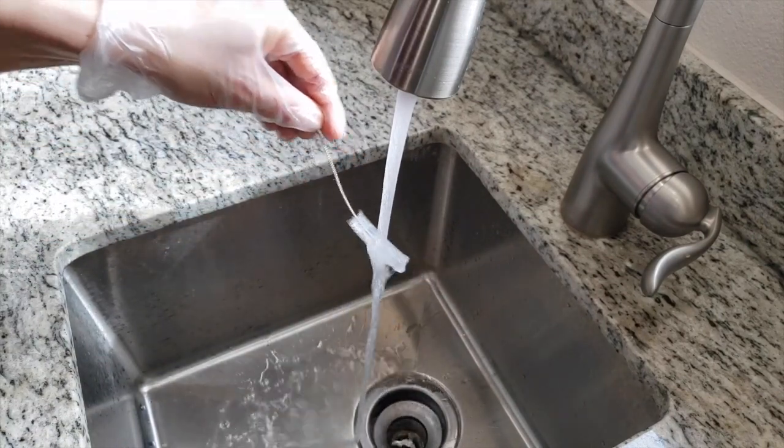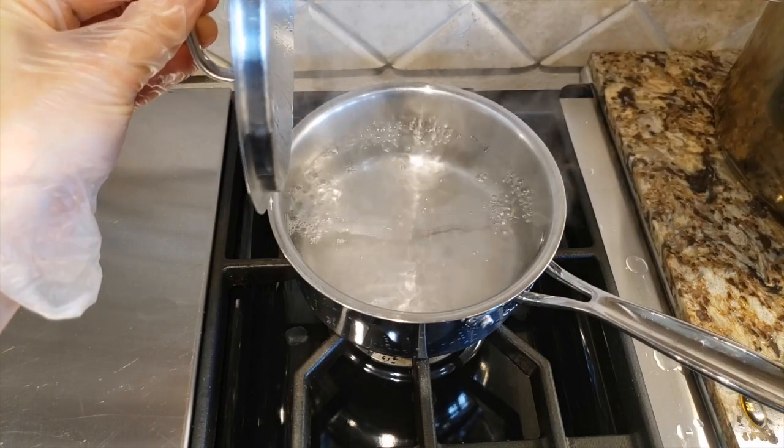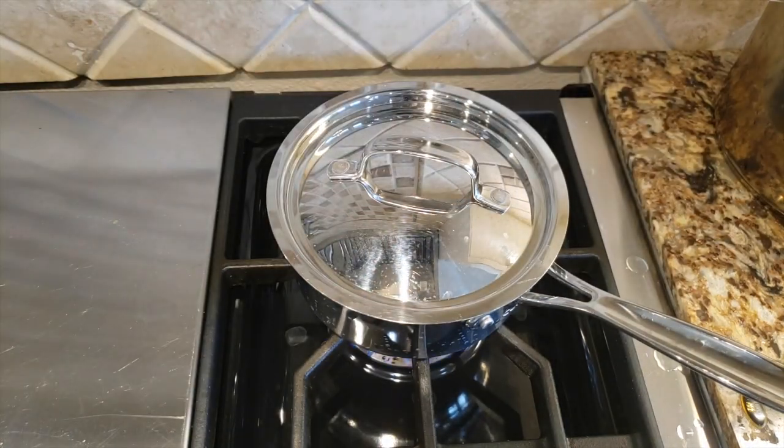Rinse off the tracheostomy tube brush in water and place the brush into the pot of boiling water. Place the lid back on the pot and turn off the heat. Allow the water to cool to room temperature.